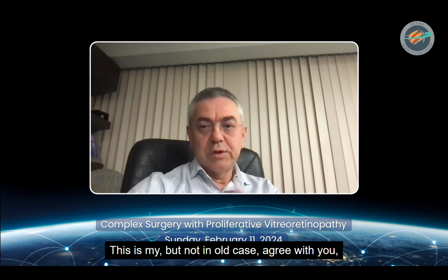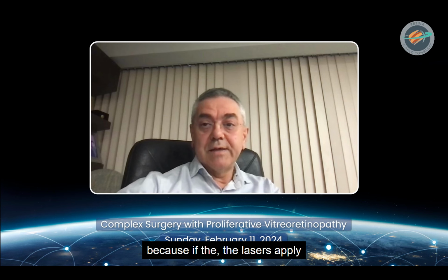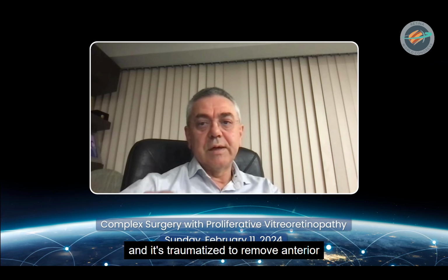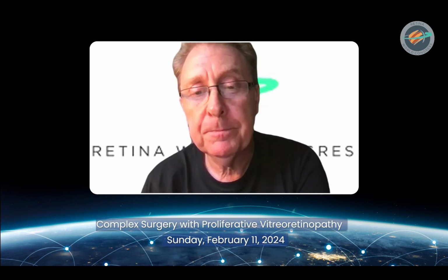This is not in all cases, I agree with you, but in some cases we can remove it. If laser has been applied and the anterior flap is attached, it's very difficult and traumatic to remove the anterior flap in such patients. Yeah. Thank you. Good point, Professor. Thank you.